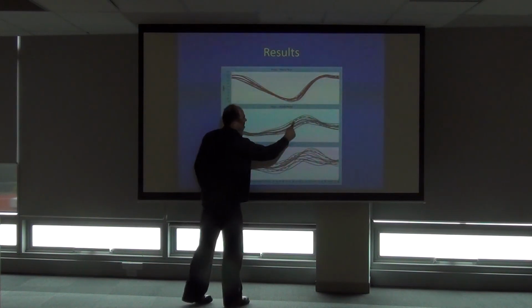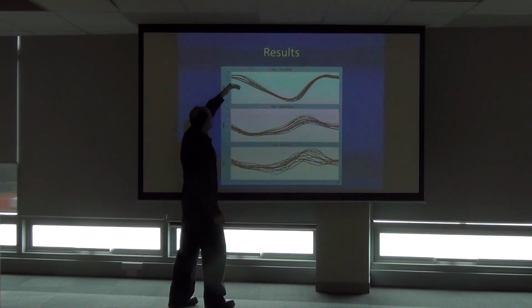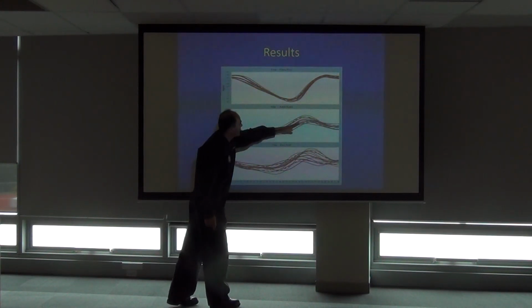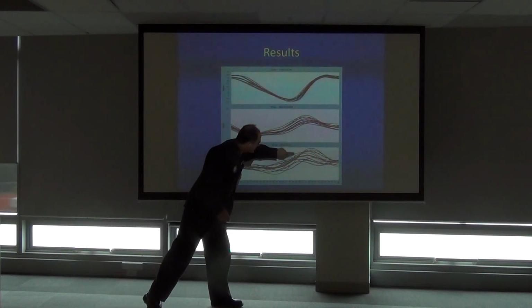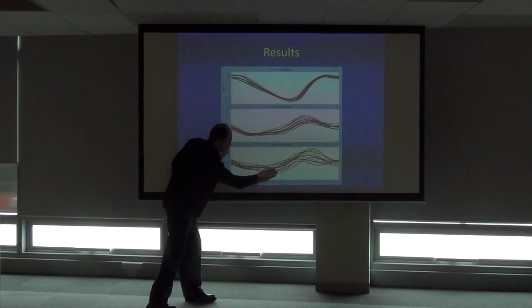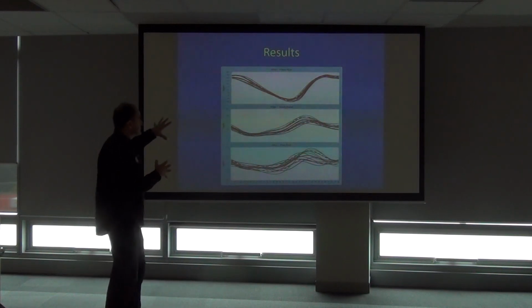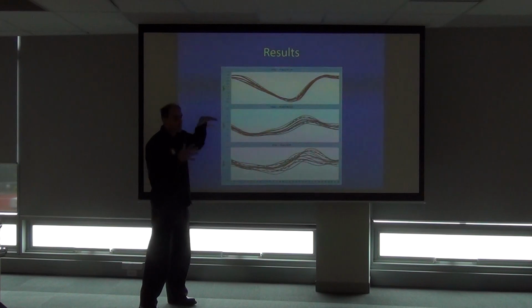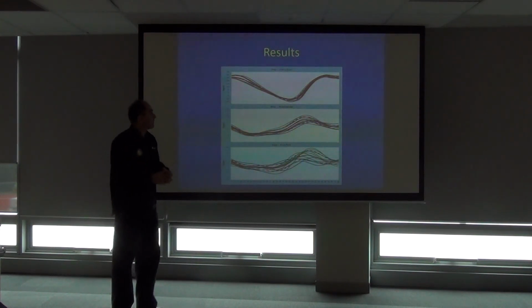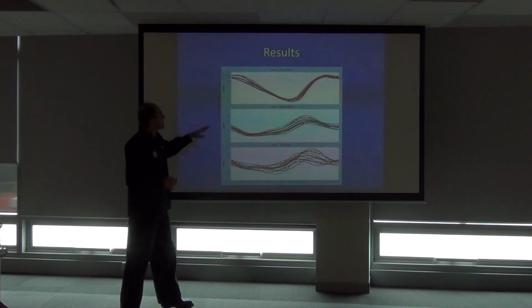The red line is the median. So there's a group on the median, purple on the median, purple on the median, and a group above and a group below. Group above and a group below. And slightly visible here as well, the median and a group above and below. There would appear to be some variations within the individuals into some subcategories or types of patterns at the hip.